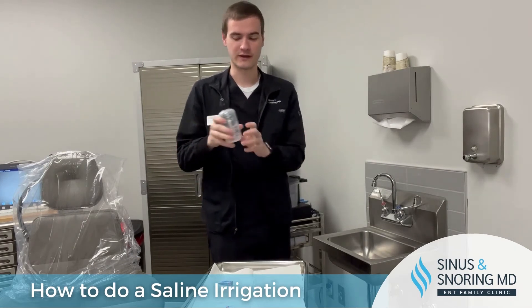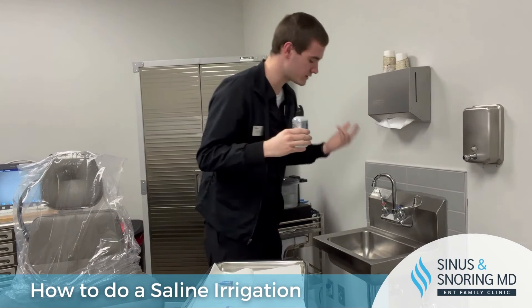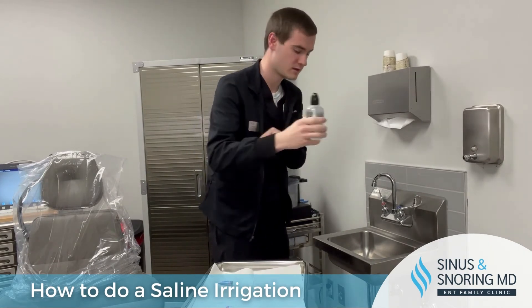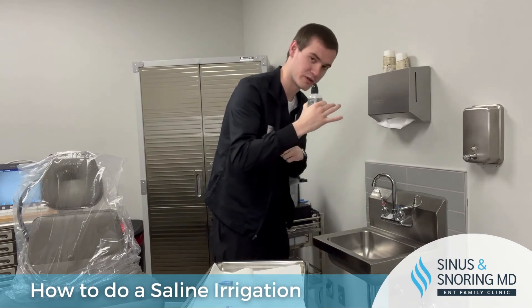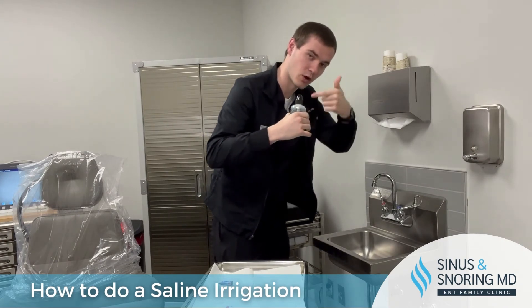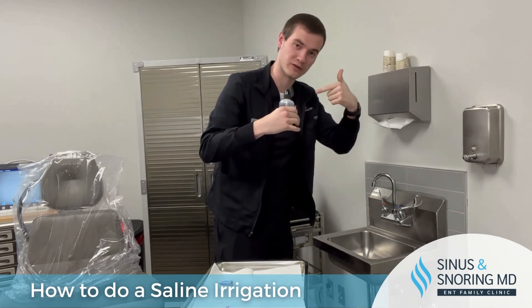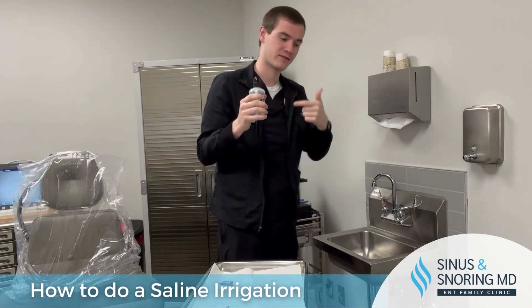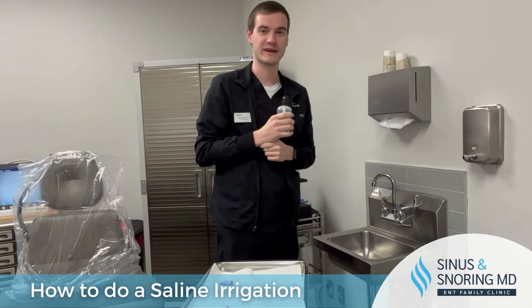Now this next part is the weird part. What you're going to do is lean over a sink, make a seal with one of your nostrils at the top of the bottle, place it against your nose, and squeeze firmly and slowly. Water will go up one side of your nose and down the other. Generally, you do one full squeeze on both sides so that water flows through both sides of your nose.